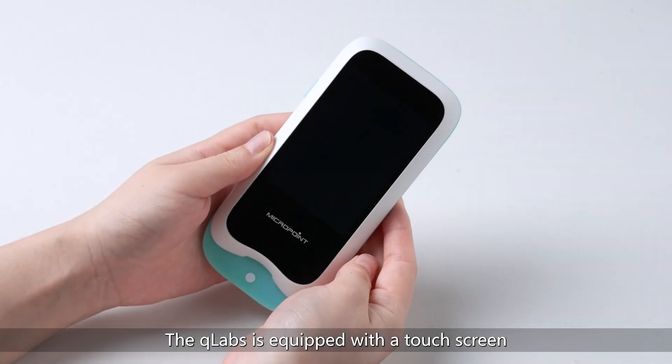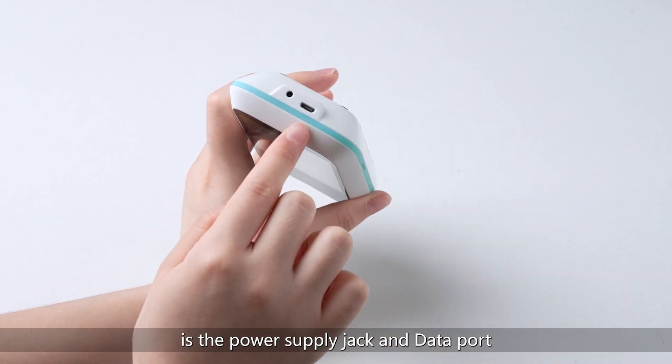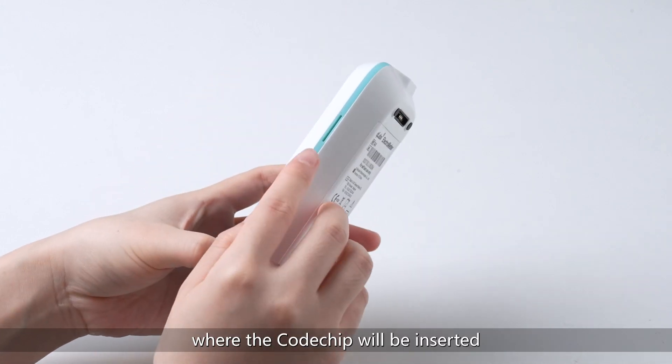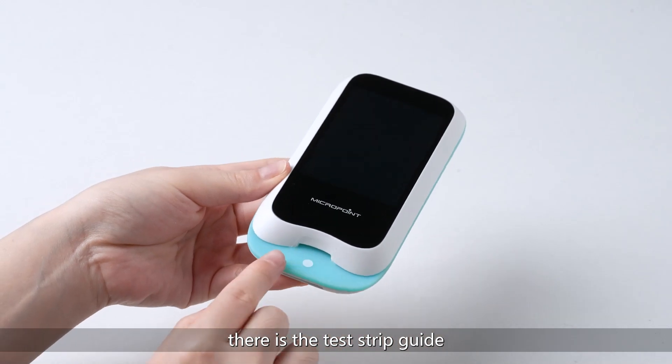The Q-Labs is equipped with a touch screen. At the top is the power supply jack and data port. On the left side of the meter there is a power button. On the right, there is a code chip slot where the code chip will be inserted. At the bottom, there is a test strip guide.